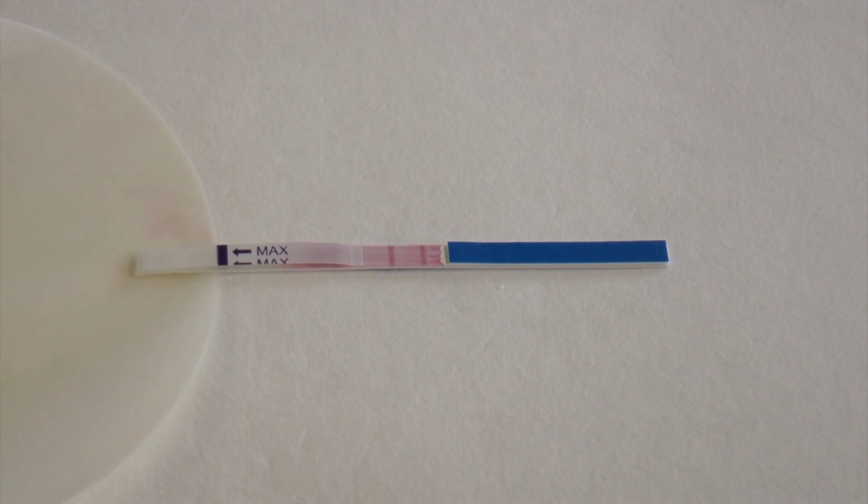Once we reach the test line, then that line becomes coloured because of this cooperative binding event with the fixed antibodies at that position, and then as it continues we also get a binding event at the control line, and that is because some of the antibodies have gone past and been bound to that control line, just to show that the test has worked. And again, remember that binding event doesn't depend on the presence of HCG, because it's just those fixed antibodies at the control line binding to the coloured antibodies.